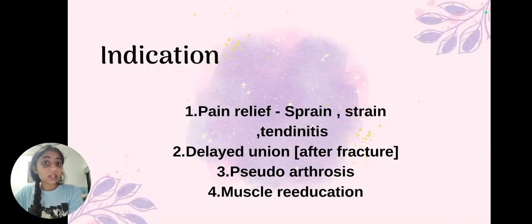Indications: in which conditions can we use IFT? In pain relief, sprain, strain, tendinitis. Delayed union, means after fracture we can use IFT. Pseudoarthrosis, muscle re-education.